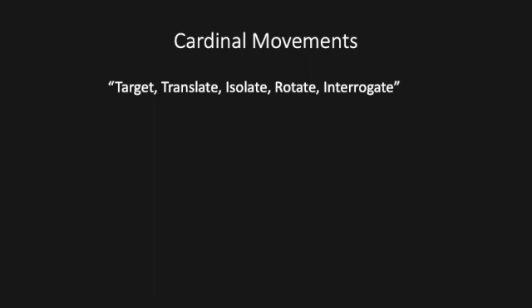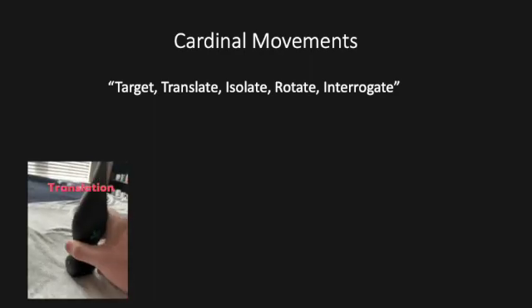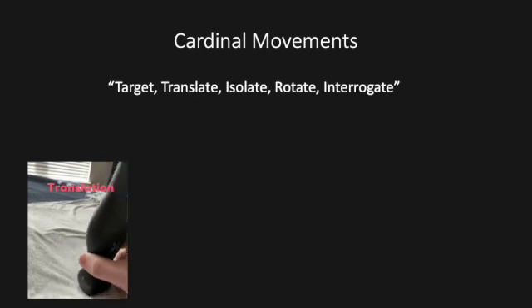What this overall means, this rhyme, is that targeting stands for thinking about the anatomy that you know or using your physical exam to try to find the organ or the area that you're looking at before you even place the ultrasound machine on the patient. And then once you do, you're going to slide the probe or translate it, and here's an animation of that, to the area to get that organ in view.